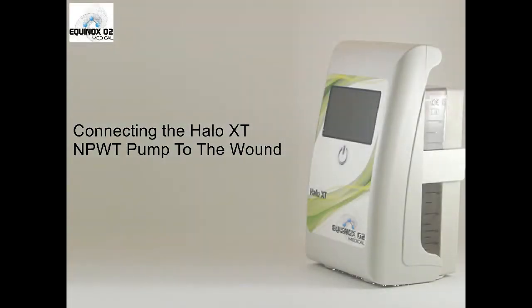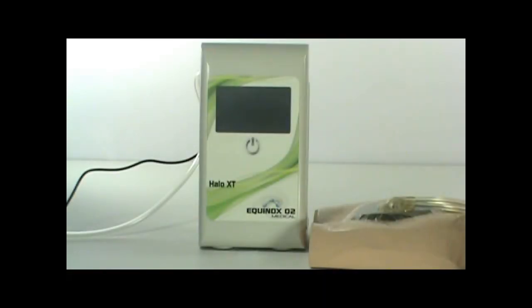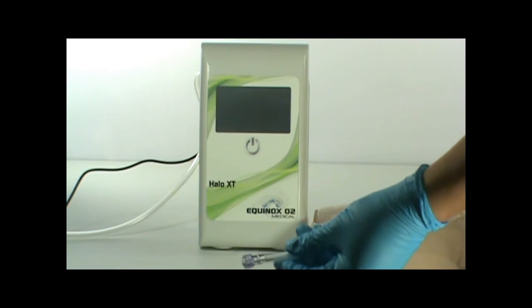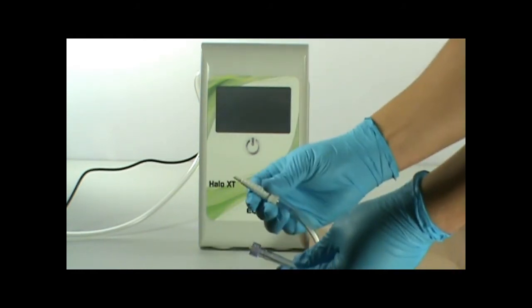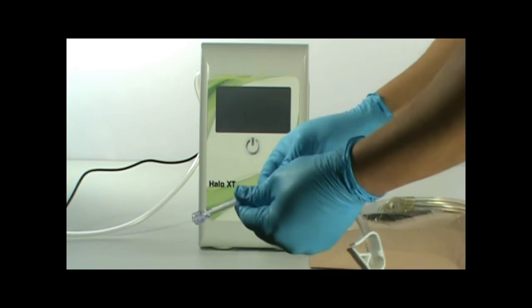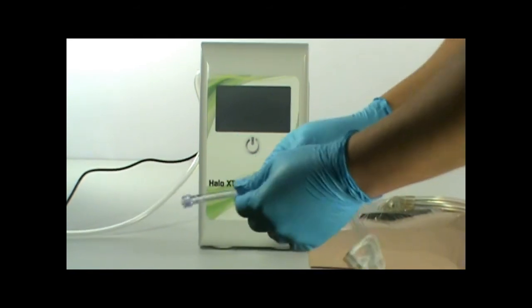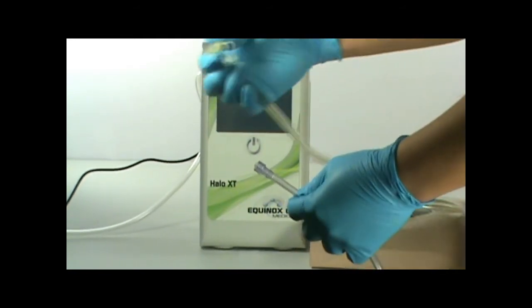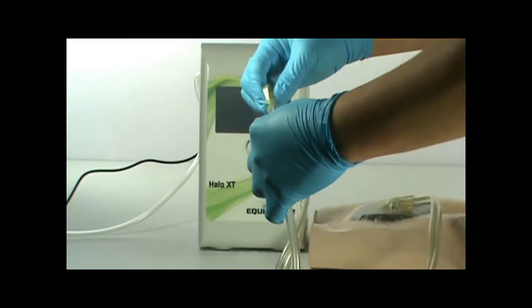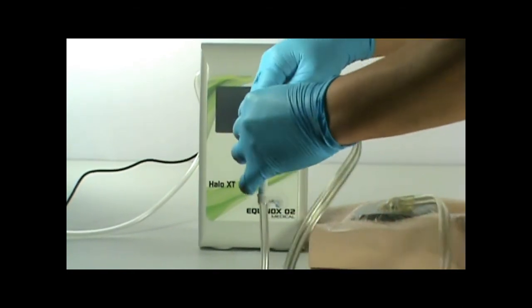Connecting the Halo XT NPWT pump to the wound: First, grab your universal adapter. Connect the universal adapter to your canister tubing. Connect the adapter to the dome pad tubing like so, twist and secure.